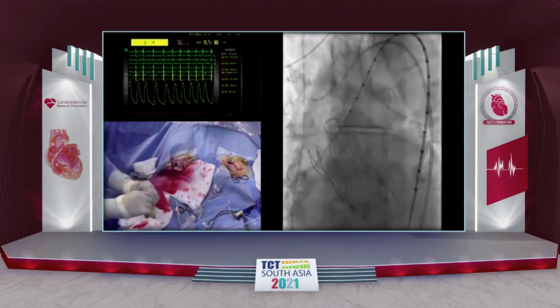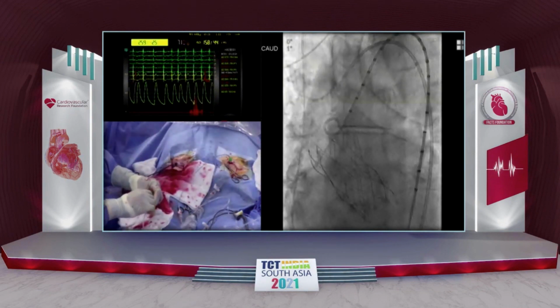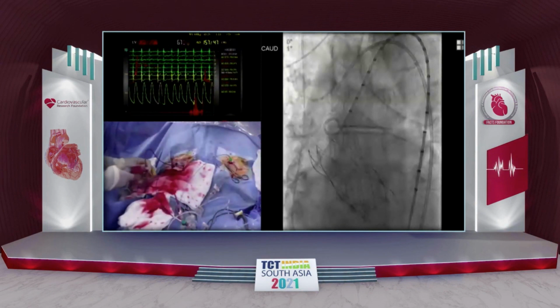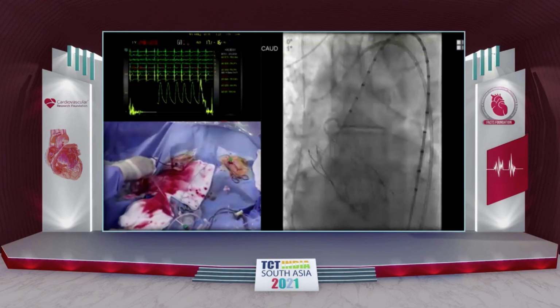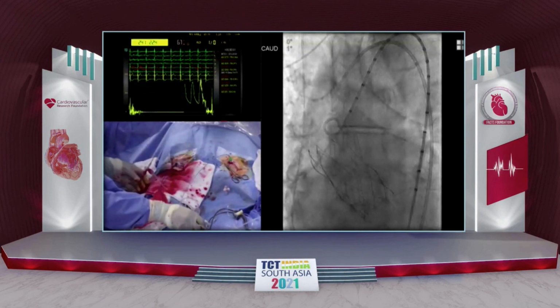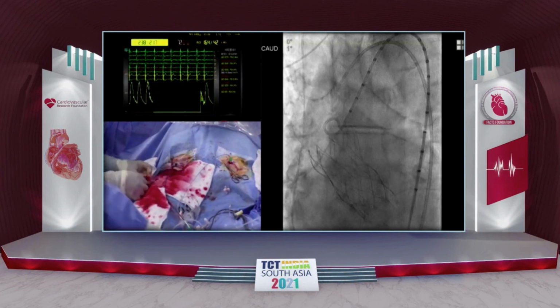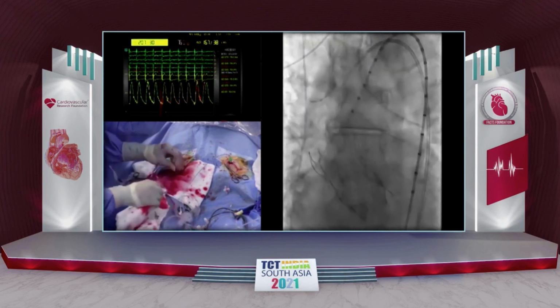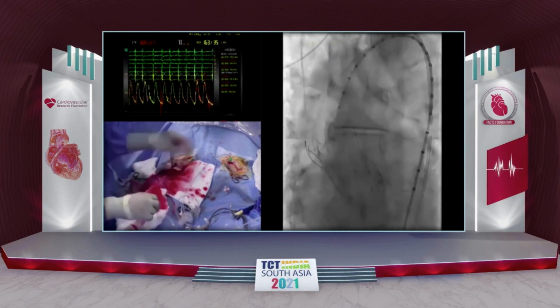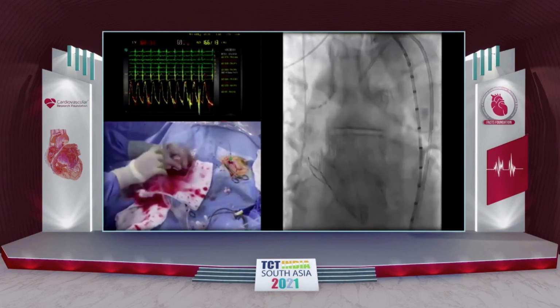Wire out. So Usman wants to always recross. You always recross? Yeah, that's a good point. I must say I have always recrossed, and one of the reasons is that we usually are part of some study somewhere, and one of the requirements of these studies is to have invasive gradient assessments. Do you worry with these big cells when you recross that you go through this frame? That's a good point as well. Usually I go with a pigtail and I don't go with a wire neat. Go to normal fluoro, please.